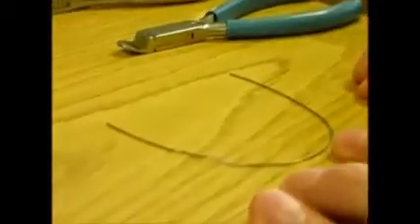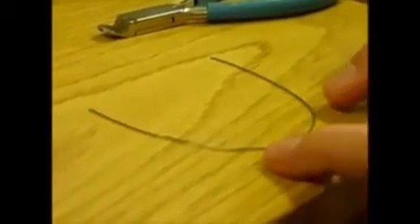Yeah, and you try and everything should still be flat on the table at this stage. Reasonably flat, isn't it? Yeah. And we usually test them by just pressing on the front of the wire here, because that curve, if it's difficult to explain, but if it's got a bucket handle on it, if you can imagine a bucket handle, then if these were 2 hinges on a bucket, then this bit would rotate up. Yeah, and it's very easy. Then when you press it down on the table across the anterior bit, you'll find that this lifts up at the back. So if you just press gently on there, you know that it's all completely flat, because this last time is going to be flat.